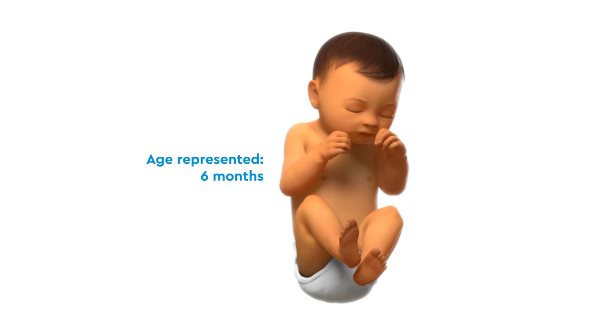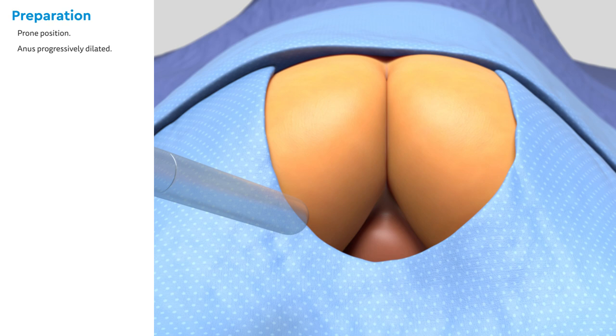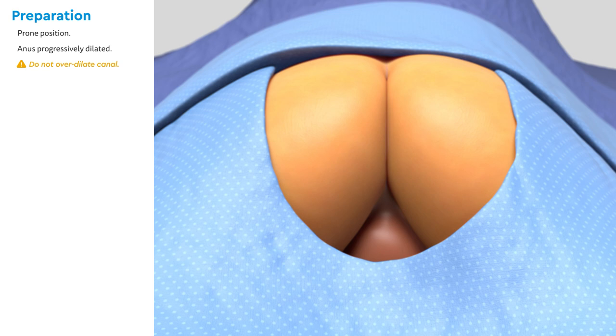This operation is suitable for patients ages one to six months. In this demonstration, a six-month-old male model is used. The patient is placed in the prone position. The anus is progressively dilated using several sizes of dilators. The first HIGAR is number eight, and the last HIGAR is two millimeters bigger than the appropriate HIGAR size for the age. It is essential not to overstretch the anal canal during this process, as doing so may damage the anal sphincter and contribute to fecal incontinence.